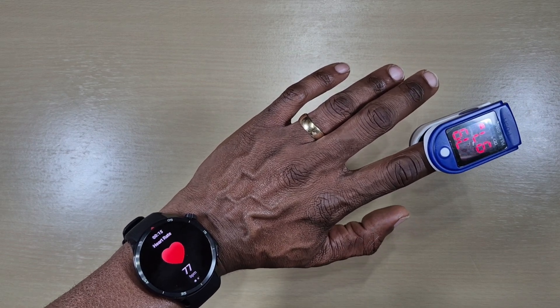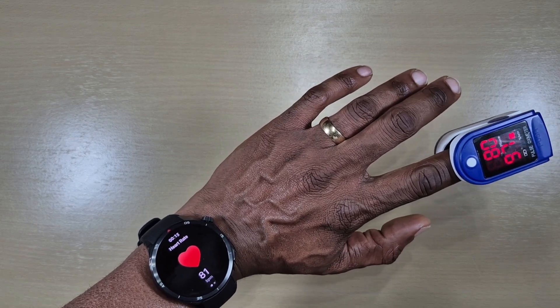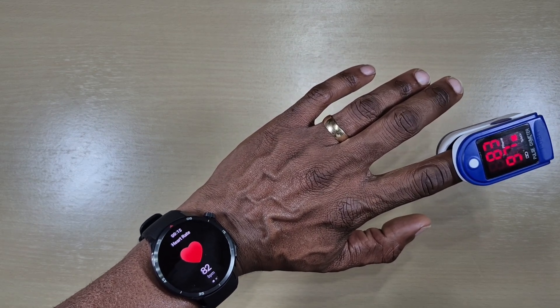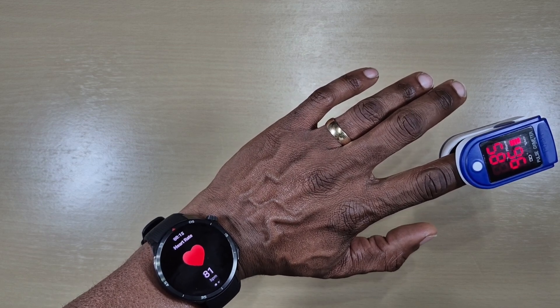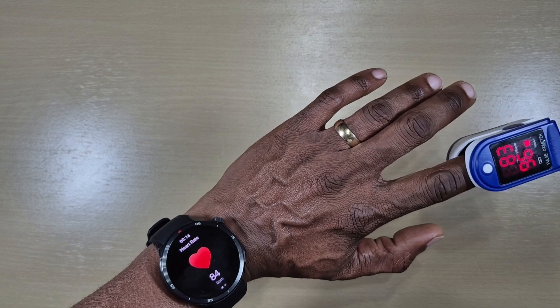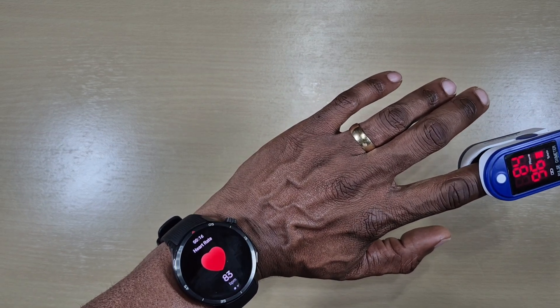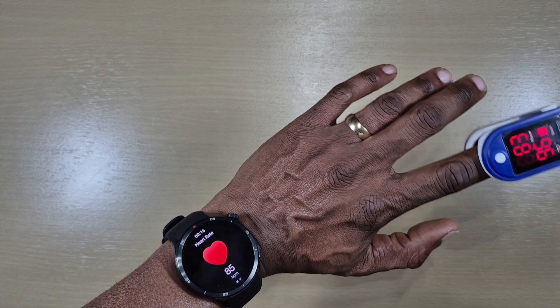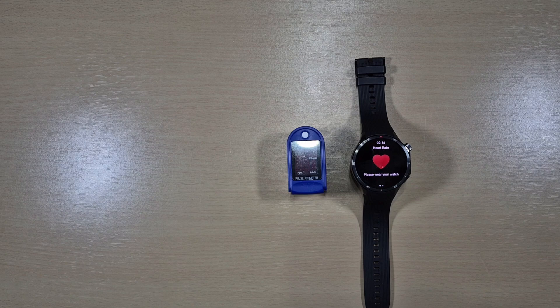As you can see, the OnePlus Watch started off pretty high compared to the meter itself, but now it's near enough the same — it's 85 against 81. The OnePlus Watch picks up changes a bit slower, but as you can see it's pretty close.